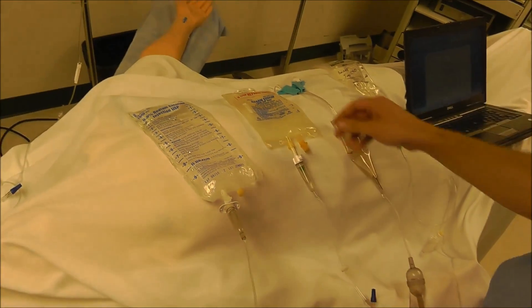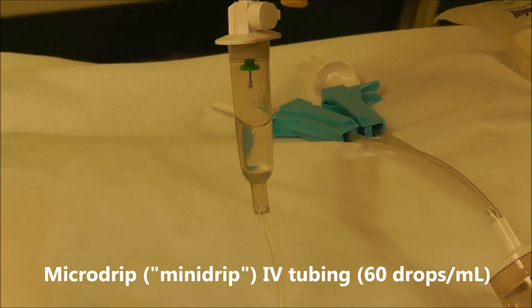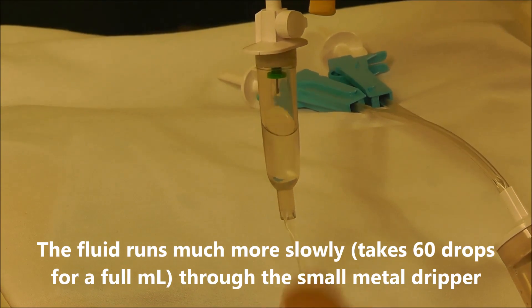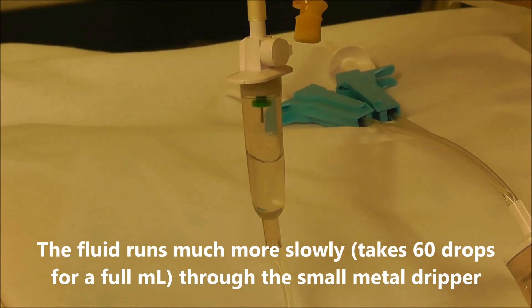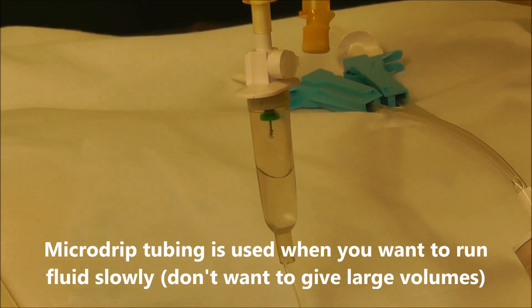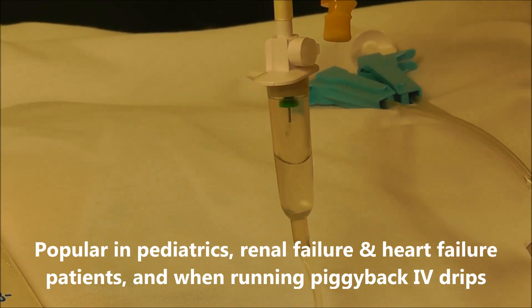The next type of IV tubing is mini drip IV tubing. I'm going to open the roller clamp here and you're going to see that those drops are much smaller. With this type of tubing it takes 60 drops to deliver 1 cc of fluid to the patient. You use this type of tubing if you want to run fluid more slowly — for example in pediatrics, renal failure patients, or as a piggyback IV infusion.